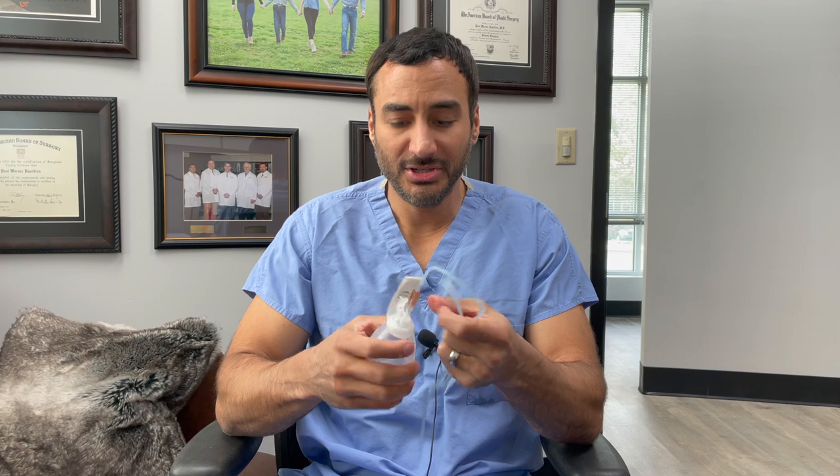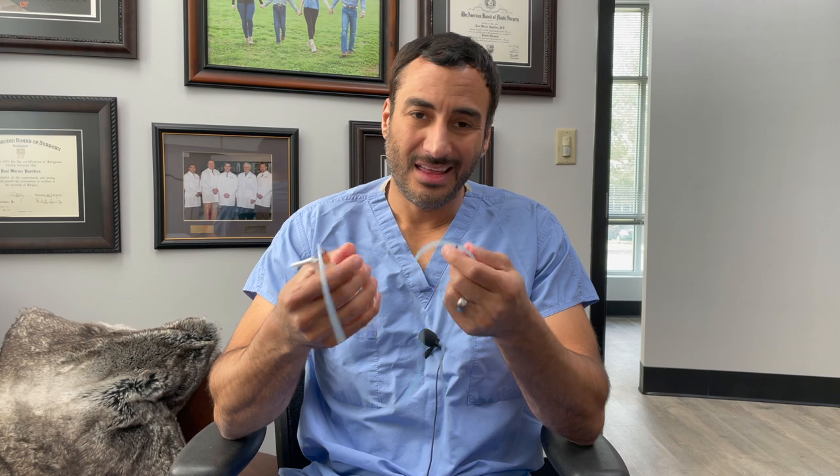Troubleshooting number two: let's say you cap the tube and it fills up immediately. If that occurs, you could have a hole in the drain tube itself, or it could be pulled out of the skin to where it's catching air. At that point, if it's not holding suction, you probably want to give the office a call so that we can see what's going on.